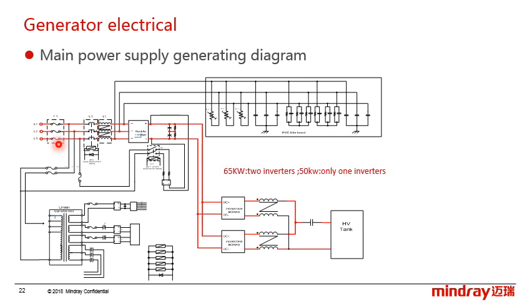The AC power goes through the fuse F1 and the main contactor K1 and the inductance L1 first, then through the rectifier bridge to transform to DC voltage, and afterwards a filter circuit to make the power smoother. Next to the inverter module.